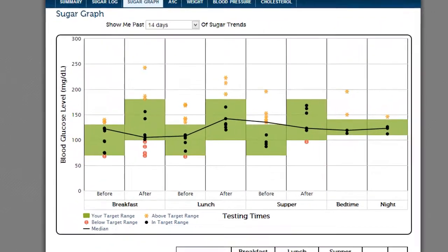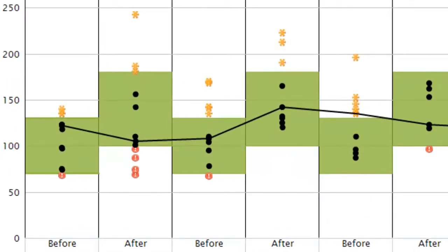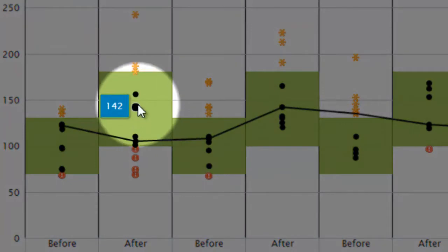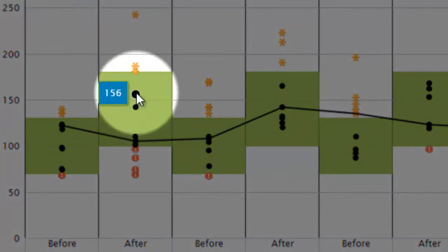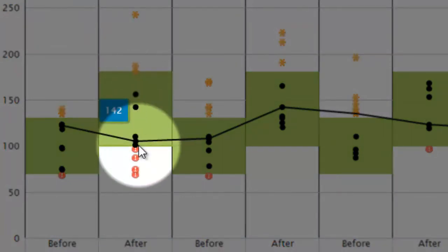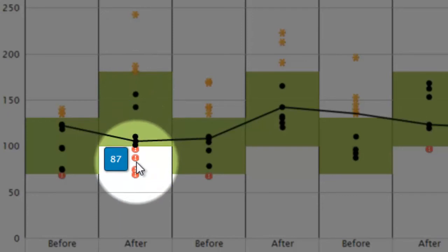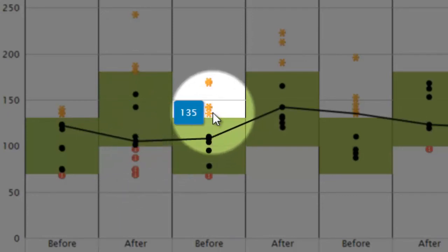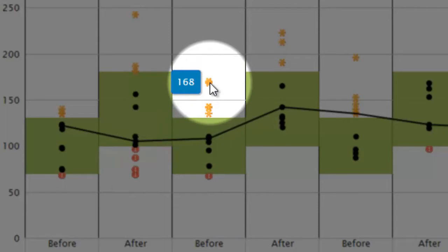Now, let's look at the graph entries. The green bars indicate the target range you have selected. If you have not selected a target range, the American Diabetes Association recommended ranges are entered for you. The black dots are your blood sugar test results that fell within your target range. Red dots are results below your target range, and orange dots are results above your target range.